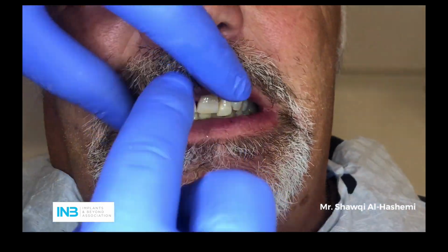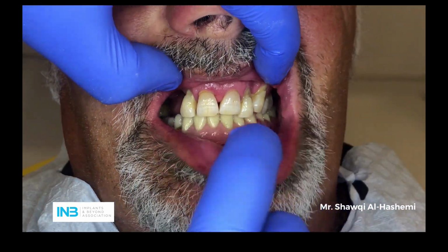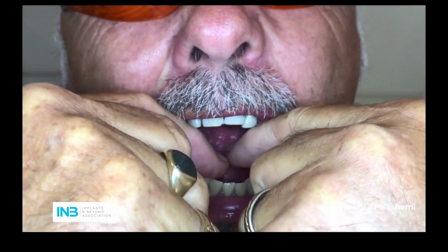Good. And bite together, first of all. How does that feel? Fine. Bite together. And how does it feel? It's good? Yeah. Biting on all your teeth? Yeah. Very nice. Okay, take it out. Very good. Okay, you're getting better now. Excellent. I'll get the hang of it.